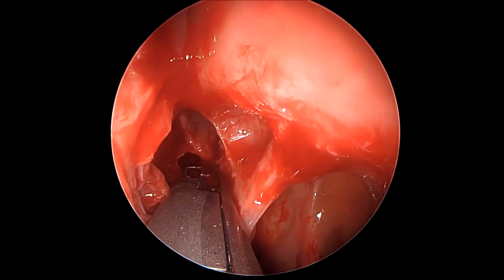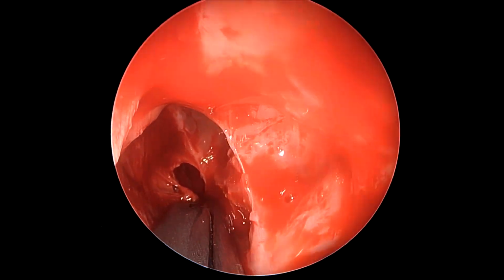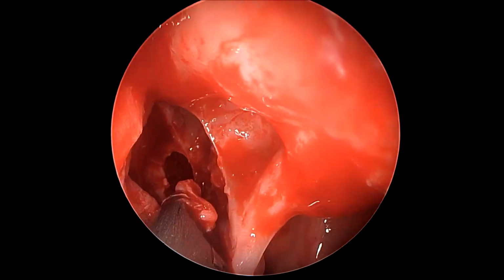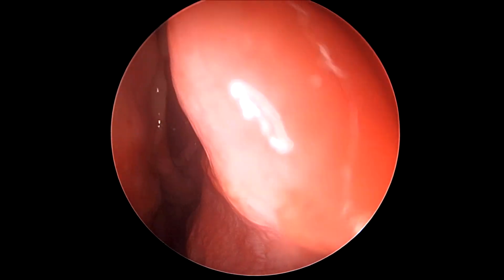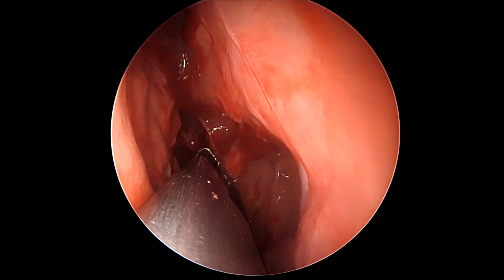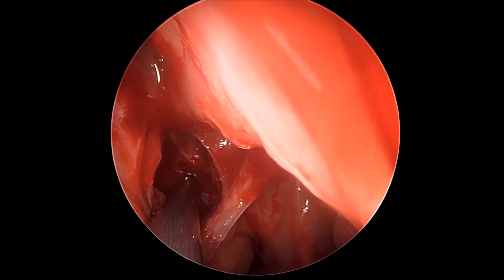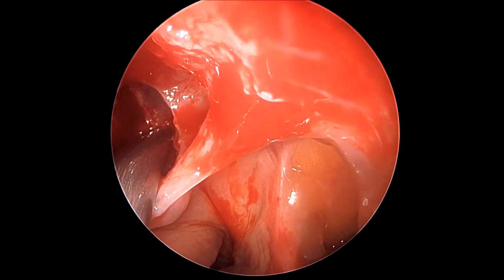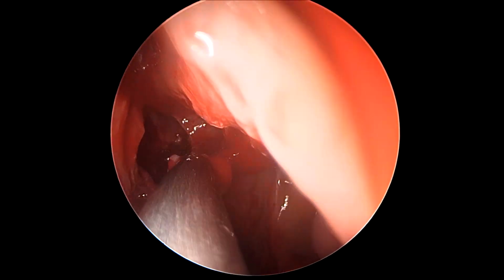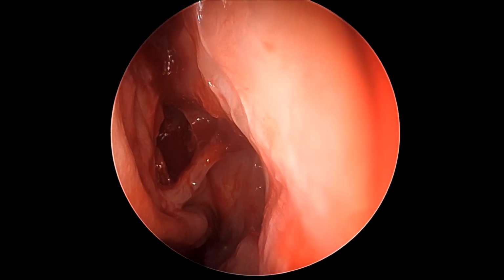So once we have done the soft tissue work with the microdebrider, we can resort to the straight bone punch to remove some bone and widen the sphenoid ostium. This can be done medially, this can be done inferiorly and laterally, just taking care not to go too inferiorly, because that would jeopardize the sphenopalatine artery, the septal branch, which would lead to unnecessary bleeding and wastage of time in the surgery.